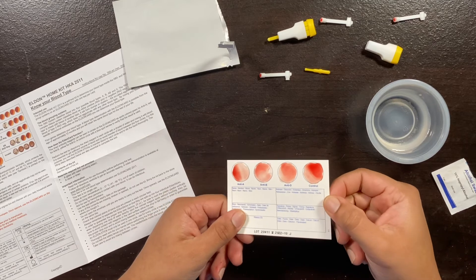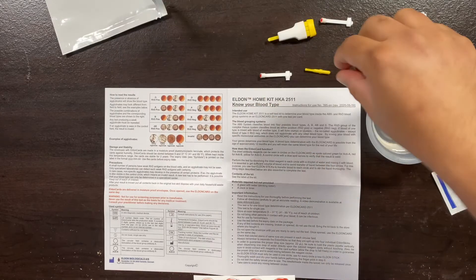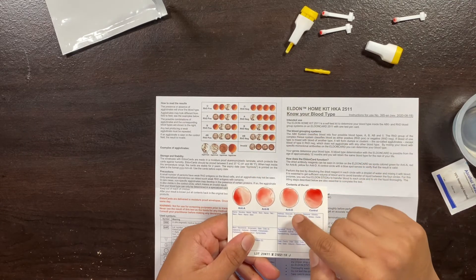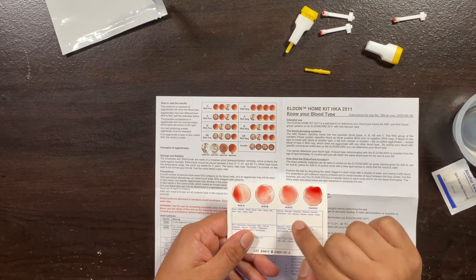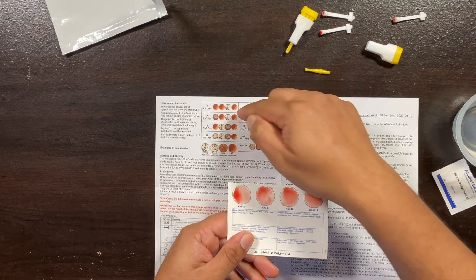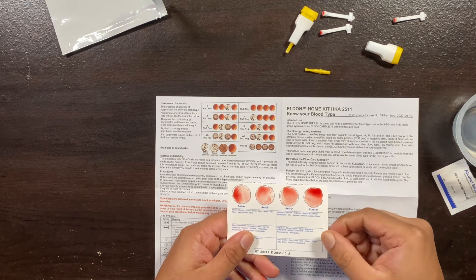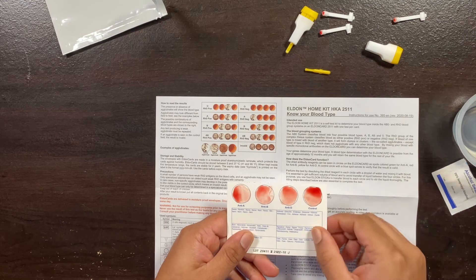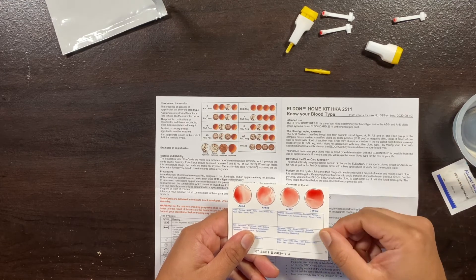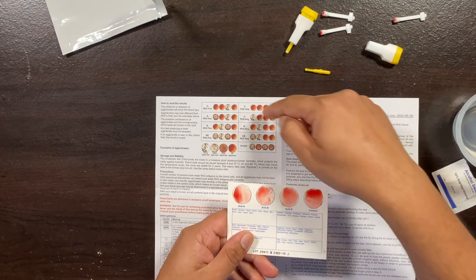Looking at the card, I don't see any reaction. The reaction should look like this: O-positive should have these two columns turn red, and antigen D should also show a reaction. O-negative should have no reaction in any column — which is true for me. I have O-negative blood type, so I don't see any reaction in any column. This confirms the test is working correctly — I am O-negative.